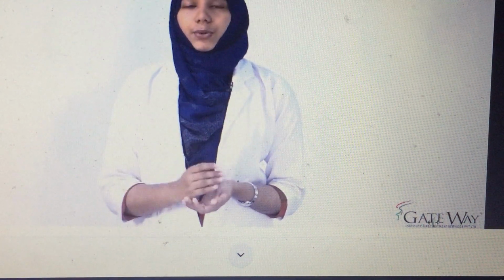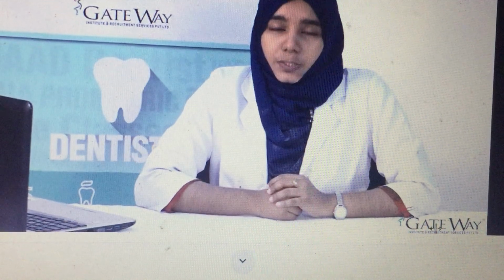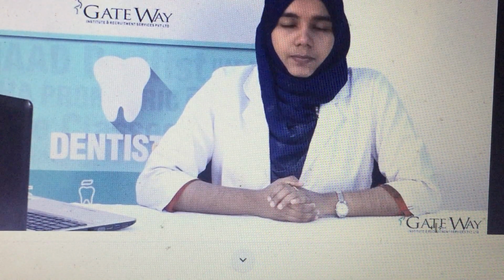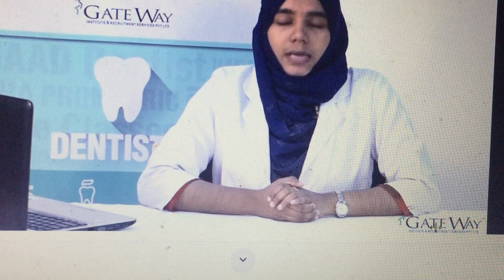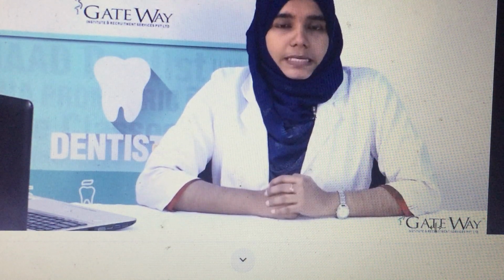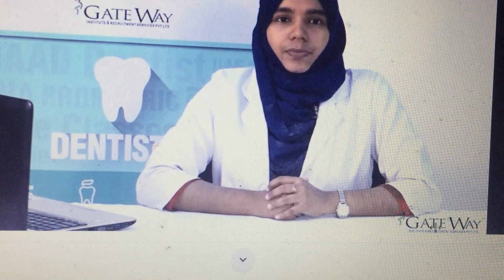Broken instruments in the periodontal sulcus. Next topic is principles of instrumentation. First principle is accessibility. Should be accessible to that area. Second one is visibility, illumination and retraction.